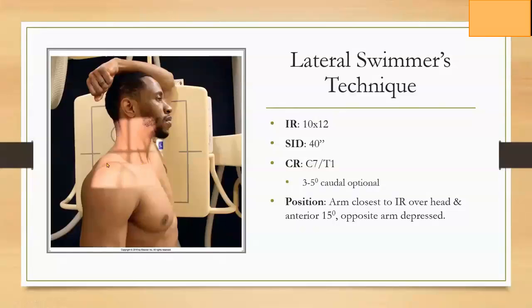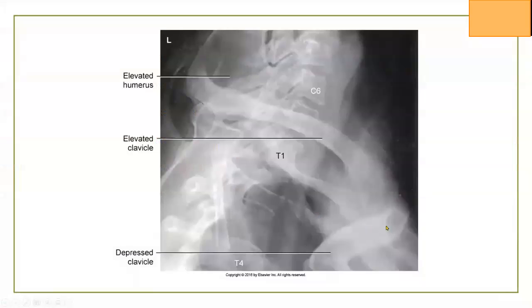Especially when you collimate down to a smaller area, you are losing the ability for the radiologist to count all 7 vertebrae or 8 to document where that interspace between the cervical and thorax lies. So open your collimator a little bit more to include all of the cervical vertebrae. I think it's just a good process to get involved with.